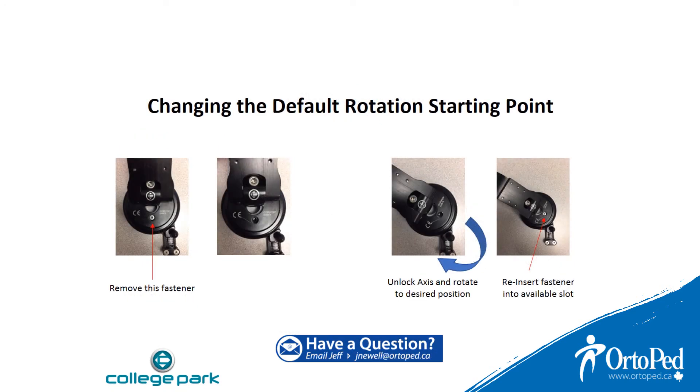There is 240 degrees of rotation in flexion and extension. The starting point can be changed depending on where you want the switch to be mounted. There is a fastener located on the joint itself — lift up the humeral plate, remove the fastener, rotate the entire shoulder, and reinsert the fastener into the next available slot. This will now be your new default starting position.